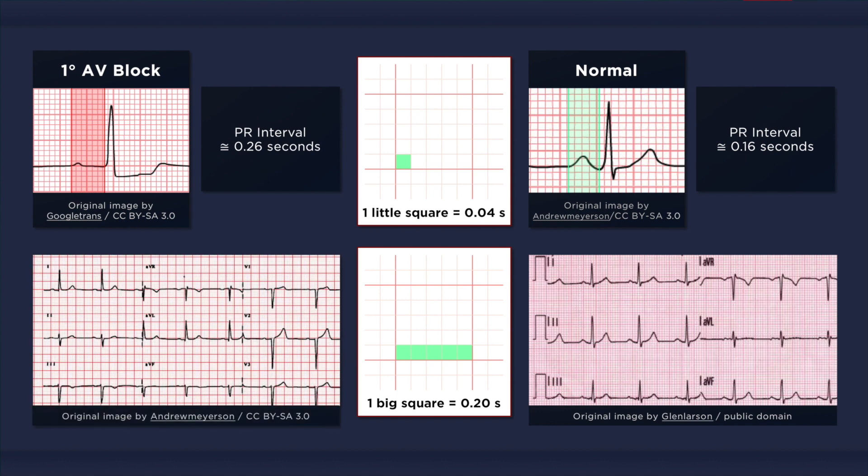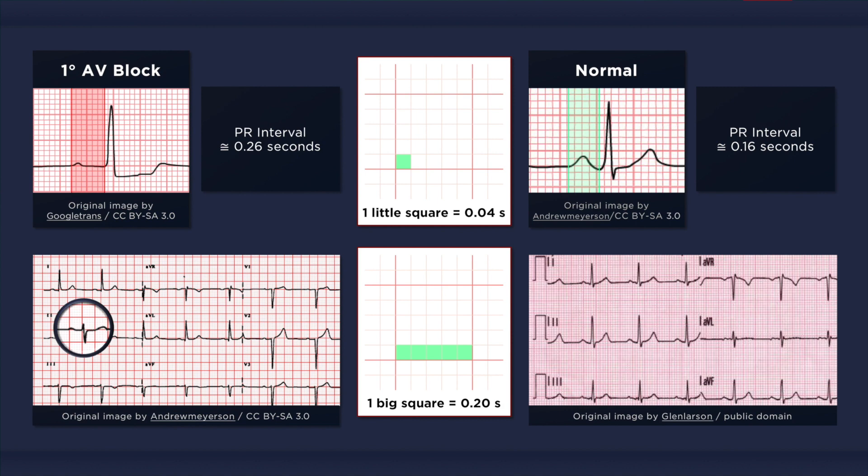Now in this ECG on the bottom left, the prolongation is less clearly evident. But on close inspection, we can see that the PR interval is indeed longer than one large box, thus it is greater than 0.2 seconds in duration.